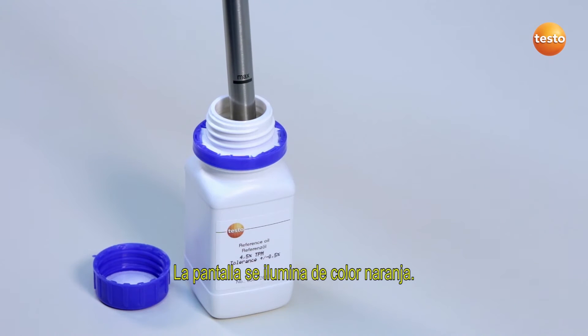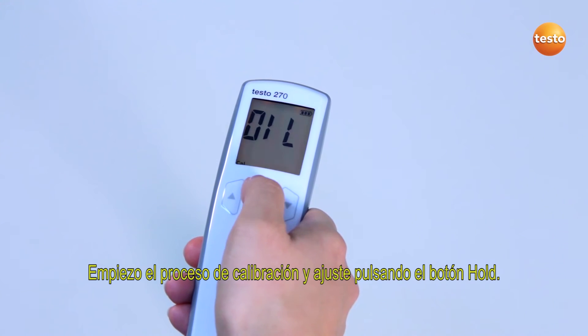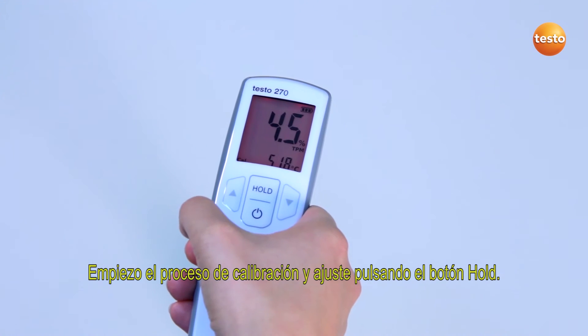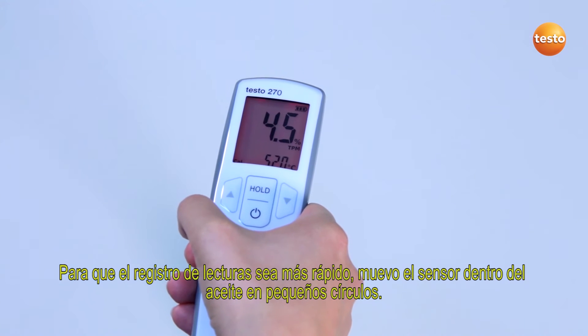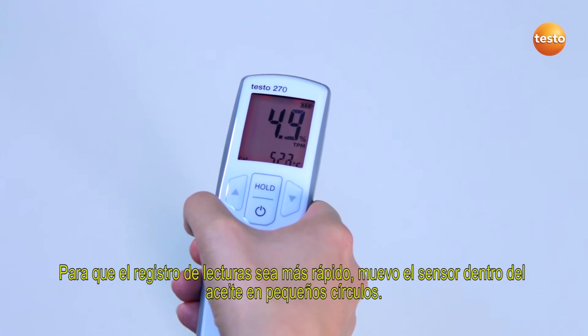The display now lights up in orange. I start the calibration and adjustment procedure by pressing the hold button. In order to record the measurement value more quickly, I move the sensor in small circles in the oil.